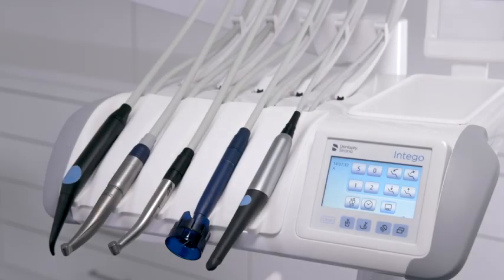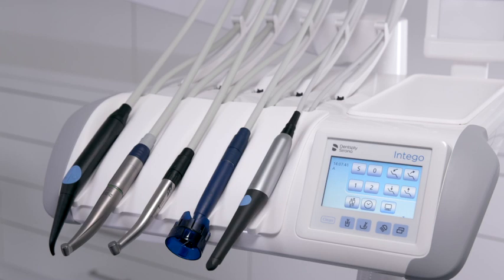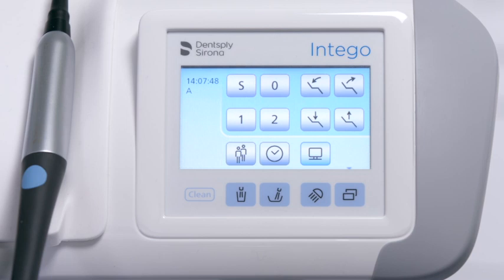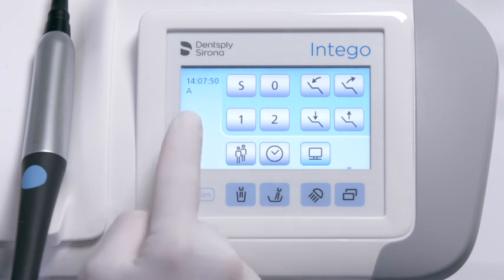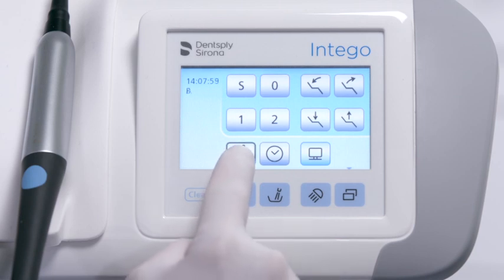The treatment center is operated via the graphical user interface and the fixed key panel. The EasyTouch user interface can be configured for up to 4 different users, A to D. The selected user is visualized on the left side. The operator can be changed via the user interface.